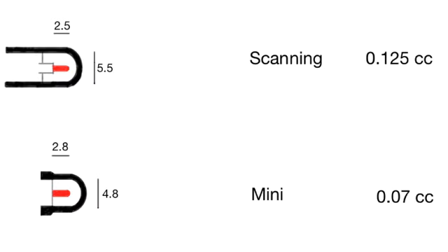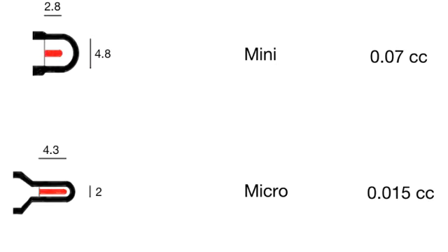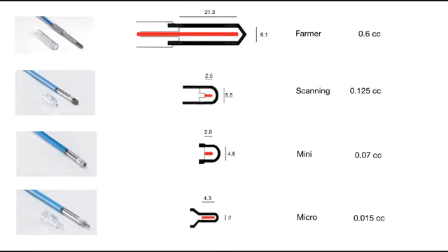Now down here on the bottom of the list, we have an even smaller chamber, the microchamber. The active area, the area where the air is, is 0.015 cc's, so that's good for measuring small fields, as we will see in a minute in more detail. Okay, so these are all the representative chamber types that I'm showing you now.